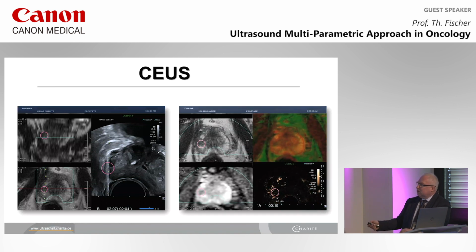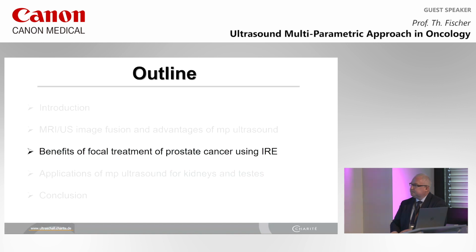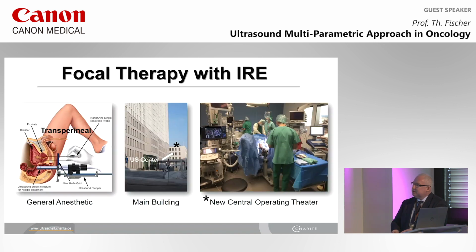Here, once again, the beautiful contrast inflow on this aggressive cancer, and you will understand the value of this technology to be sure that you are right in plane and that we have this early enhancement pattern, which is typical for these aggressive cancers. What is the benefit? The benefit is all these things focusing more and more on focal therapy of organs.